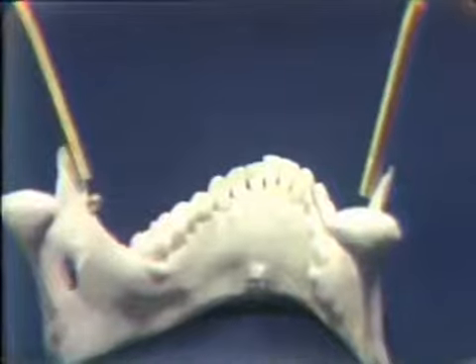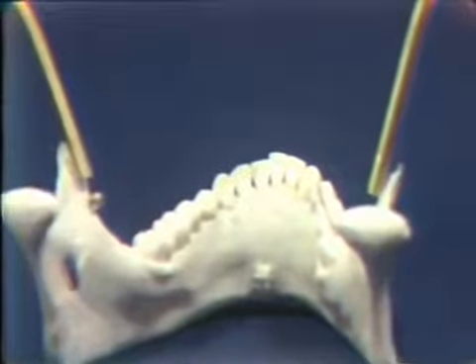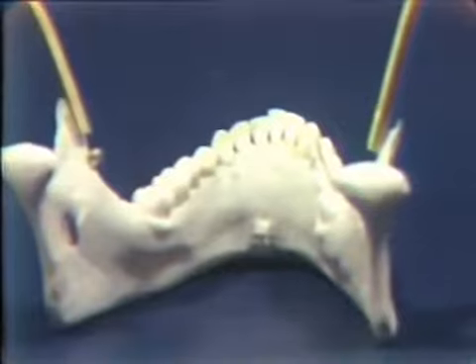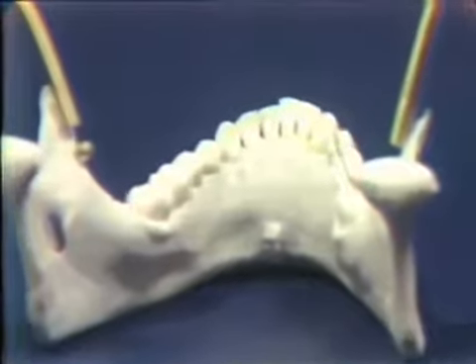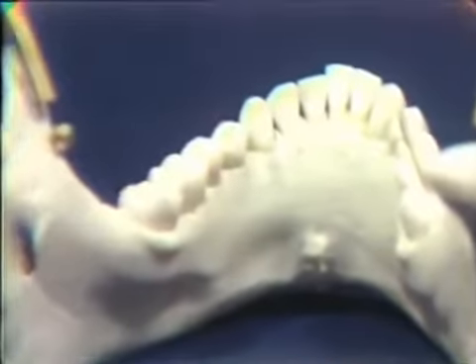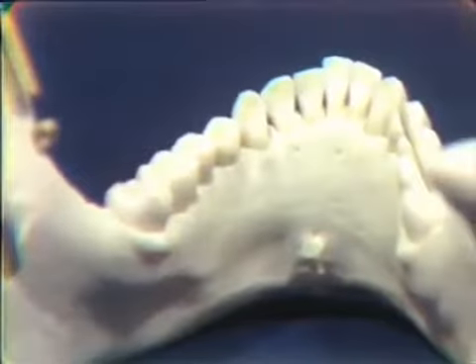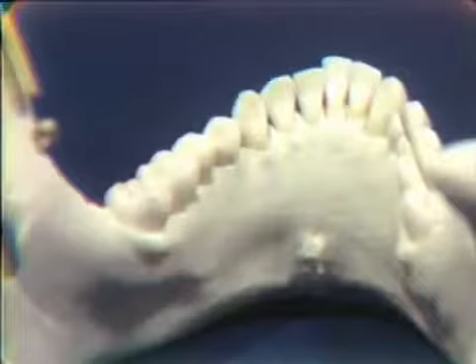I should like to demonstrate lingual alveolar soft tissue infiltration to you. Let us suppose that we were going to remove this lower left cuspid, and we'd already accomplished labial infiltration. We know that in removing this lower cuspid, by forceps application, etc., we would be manipulating these lingual alveolar soft tissues.